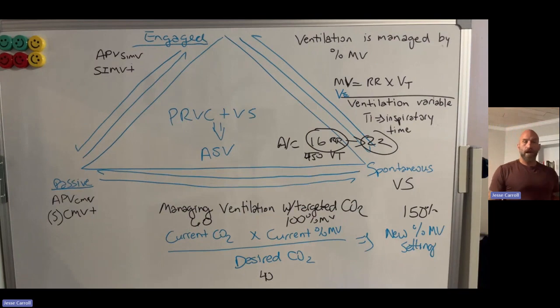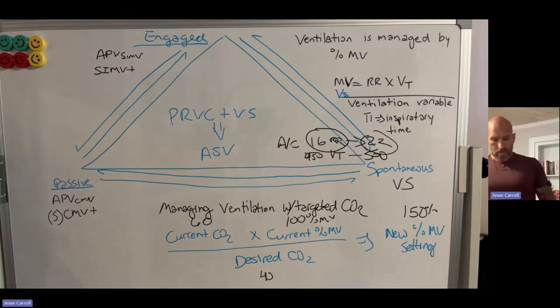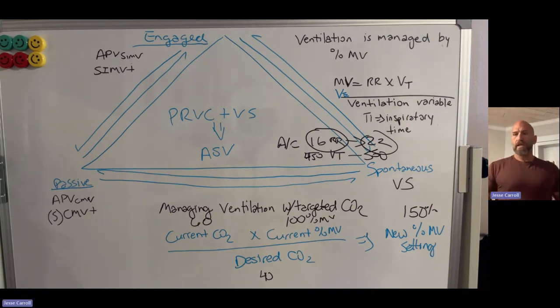And so now, again, there's an equation for that as well. So let's say they put that into the equation, and now we've changed the tidal volume from 450 to 500. 5 more minutes go by, and the CO2 is now 45. Still, now we're probably in an acceptable CO2. The medic may not do anything more at this point because they're concerned that they've already made multiple adjustments and they're not that far off. Okay, but my point being is that all of this has an impact on the patient care.